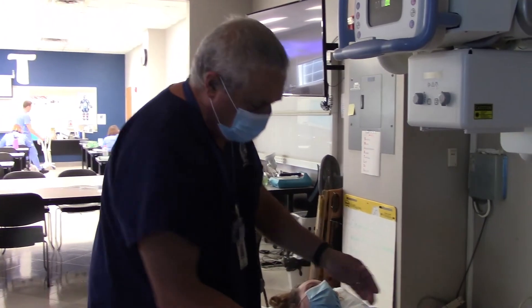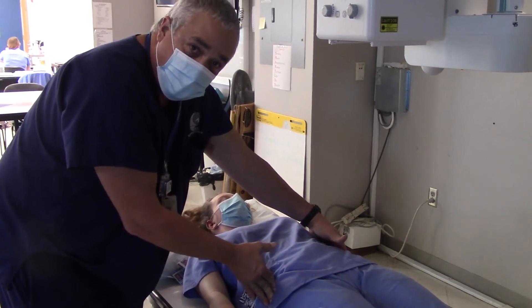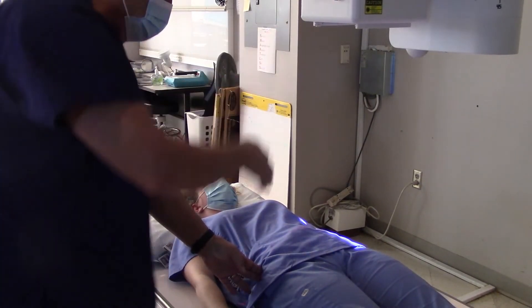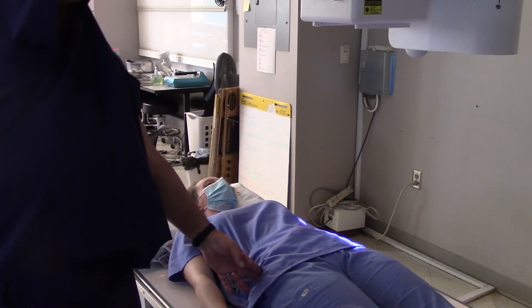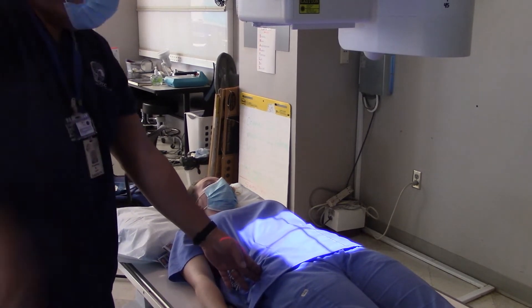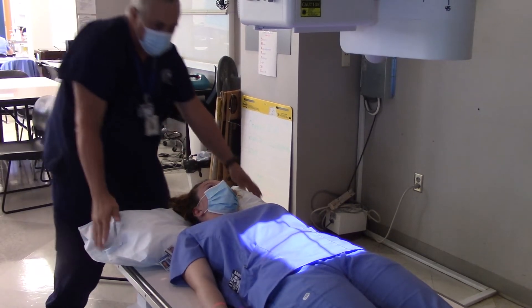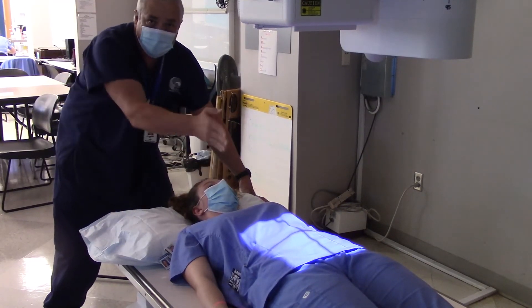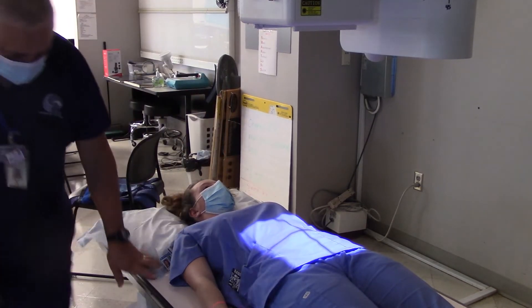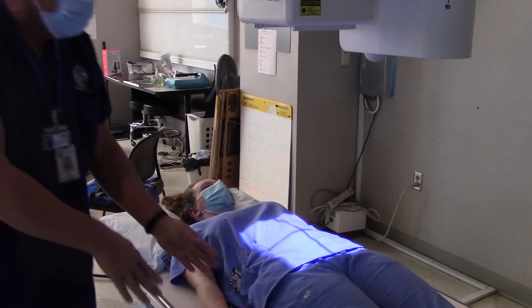I'm going to palpate my patient and find their iliac crest. Right there is where my central ray is going to be. I can go to the head of the table and look to make sure I'm really lined up on the mid-sagittal plane — and it looks like I mostly am, so I'll just move her just a skosh.